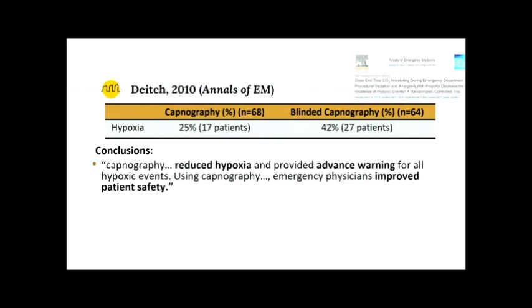And this became quite a practice. It was practice forming in the sense where people looked at this and said, this is a measure, I'm doing this procedure quite routinely. This is a way that I can improve the safety of my procedure itself. It's important to understand the limitations that were in this paper.